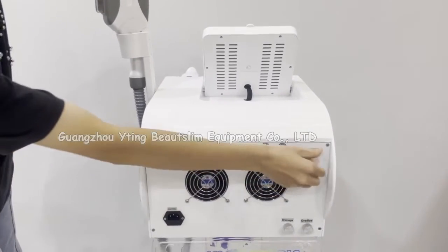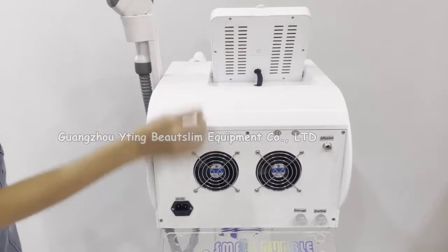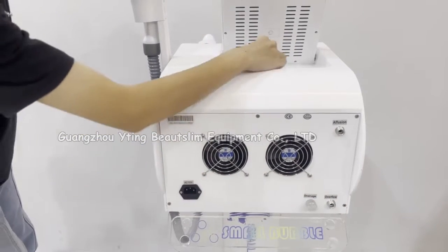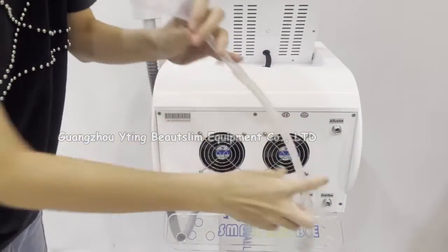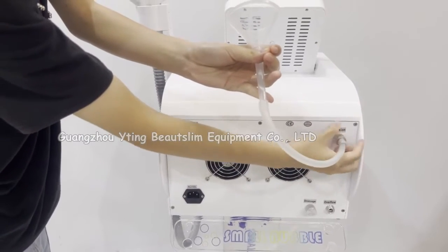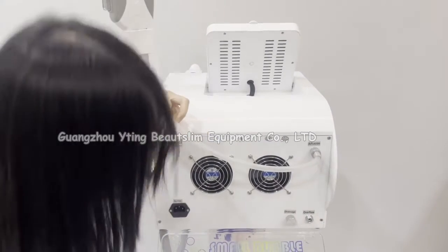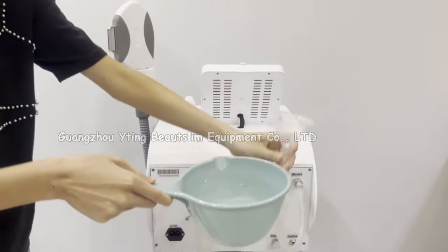Open this hole and open this overflow hole. Connect the funnel and start adding water.